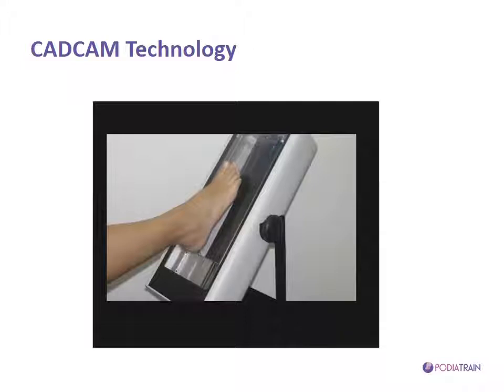The scanner, which can be utilized using several different technologies, will capture the three-dimensional image of the foot just as well as if we have casted the foot using plaster of Paris or else even impression foam. One of the methods is to actually scan the impression foam so that we can still use our traditional methods if we wish.